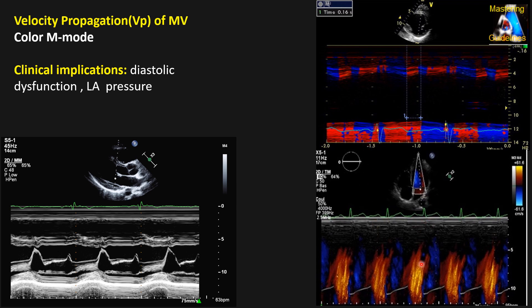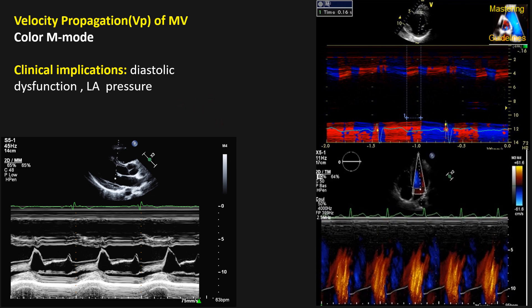Here we are going to talk about color M-mode on the mitral valve inflow, which we call velocity propagation, or VP. The most important use of this technique is for evaluation of diastolic dysfunction, and especially we can indirectly measure pulmonary capillary wedge pressure and LA pressure using this technique. Let's see how we do it.